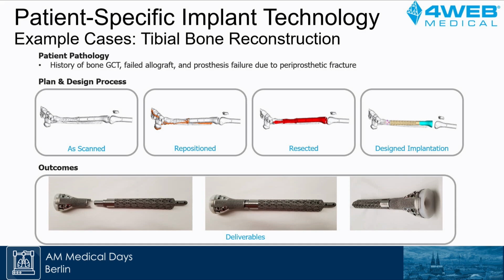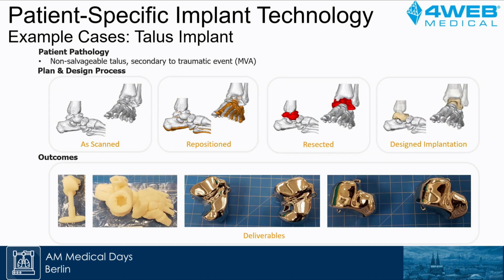One of the other advantages of the PSI system is it can be designed to work or match with other existing technology. If the surgical procedure involves replacement of a joint, like a total knee replacement, what can we do here? We can get the total knee implant component, the one at the far right, from a supplier like Stryker, Medtronic, or some other companies, and then design the bone fixation parts such that it attaches well to the total joint replacement. It gives very good results. Again, the goal is to have that space filled with bone ASAP.